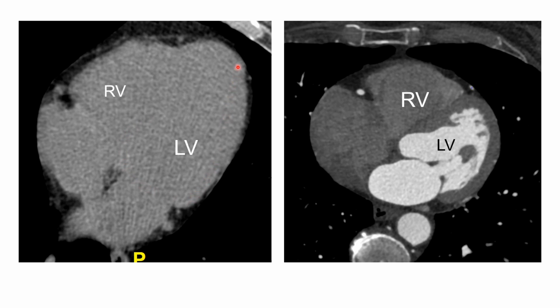The things that really stand out, if you look up in the top right corner, calcified areas show up as bright white. Whereas with the CT angiogram, since we have a bunch of contrast in the ventricle, you can see the mitral valve, you can see the right coronary lit up. So the contrast is the big difference in how the scan is done, even though they're both done in CT scanners.